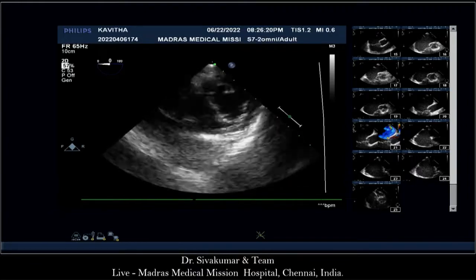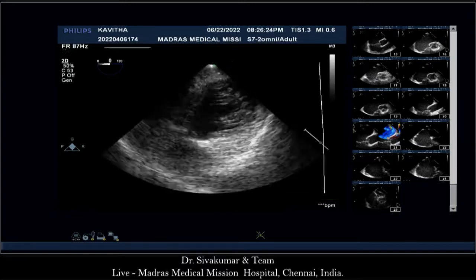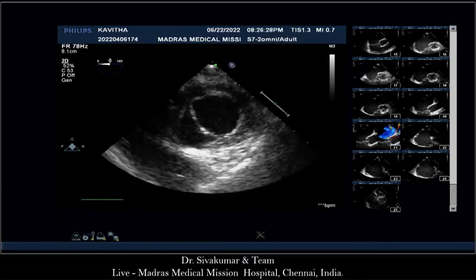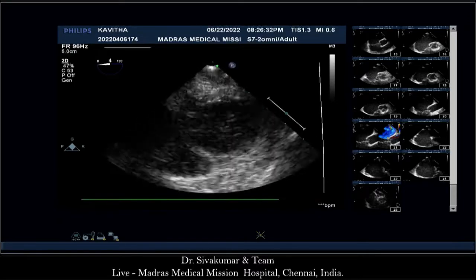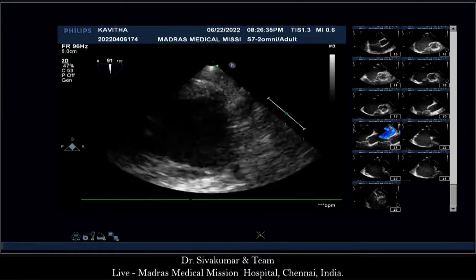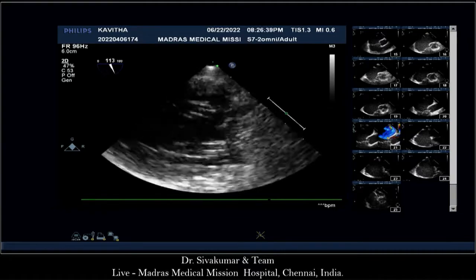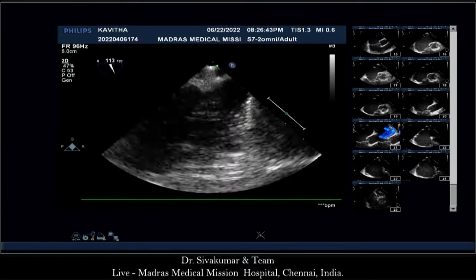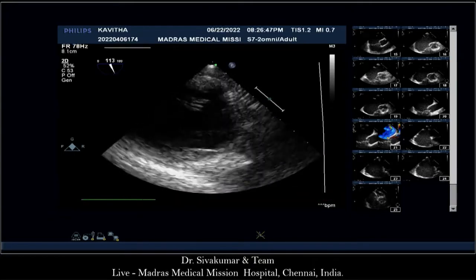This is the mitral valve in short axis. Anterior mitral leaflet and the posterior mitral leaflet. I will now get the focus onto the mitral valve. Now I am going for perpendicular to this. So this is the left ventricle in long axis. The picture is almost too big for me. Can you make it slightly smaller? I can't see the whereabouts we are.